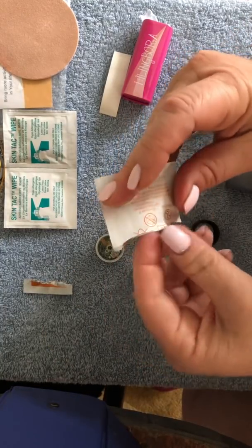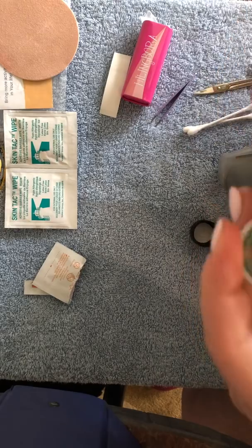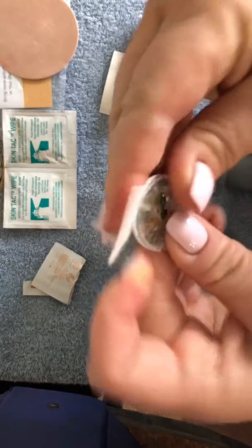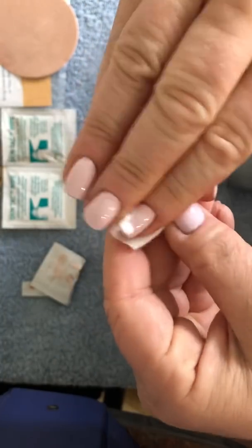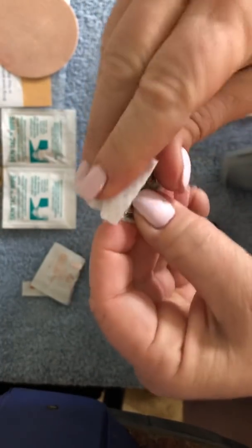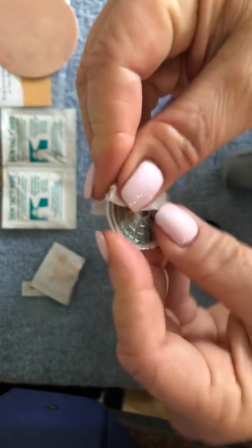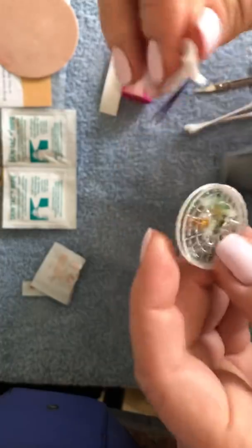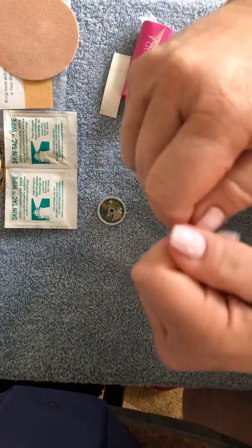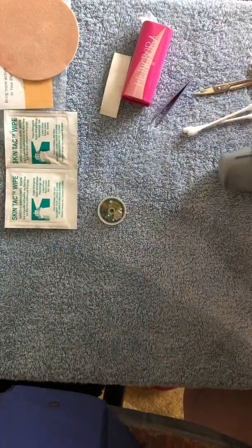and I am gonna give it a nice wipe down because the Goo Gone can be a little bit oily. Well, I shouldn't say a little bit, it is oily. So we're gonna give the sensor a nice wipe down to get all of the Goo Gone off and make sure it's nice, no oils on it. It'll help stick better if you do that, okay? So we're gonna let that dry for a little bit. And while we're doing that, I'm gonna show you what I'm gonna do next.